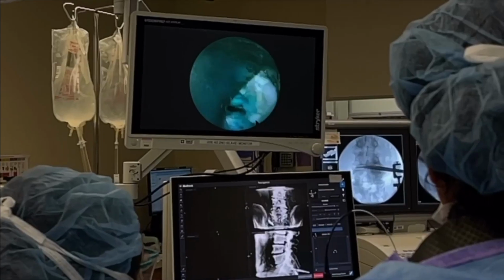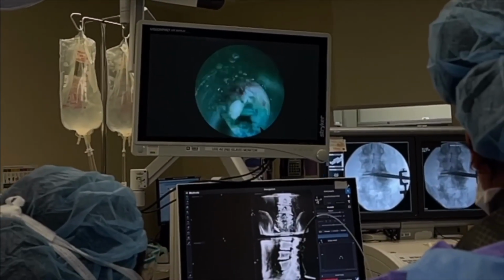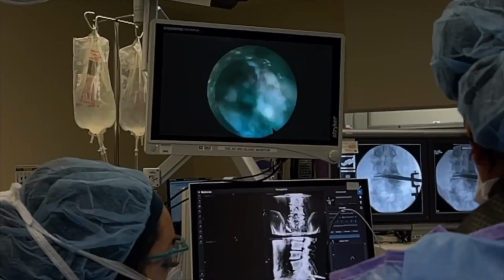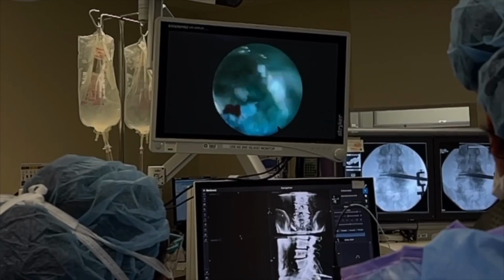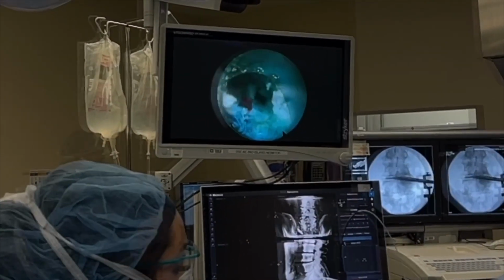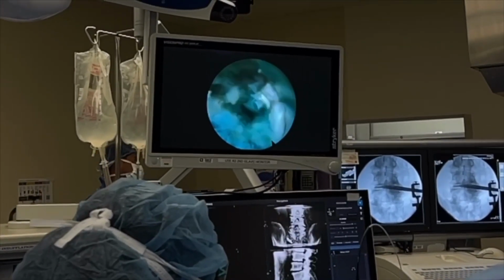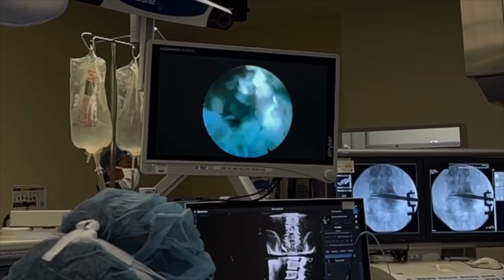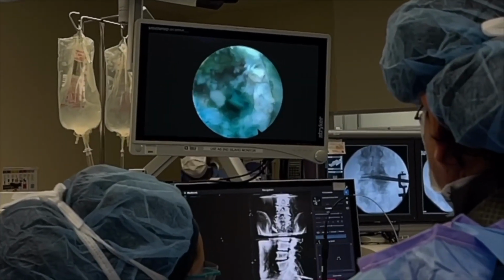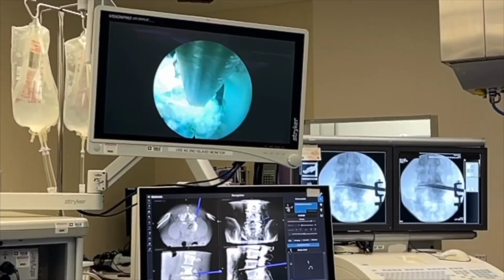Here's the nerve root right here. Oh! It's like porn. You don't want to look at it, but you can't help yourself. I'm using the tongue of this thing too. Sweep it out of the way, almost like a pimple popping maneuver. I wish you were monitoring my nerves. That would show you the degree of hyperactivity.